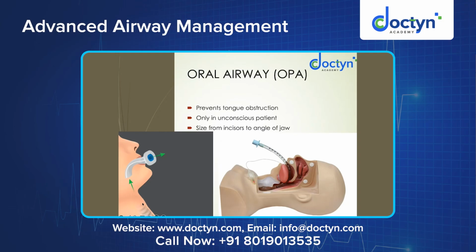So this will prevent tongue obstruction in a trauma patient where you cannot give head tilt or chin lift, or jaw thrust is not effective, or in an obese patient where even holding with two hands is very difficult and forming a seal with the mask is difficult. Putting an oropharyngeal airway in the oral cavity would improve your bag mask ventilation effectively.